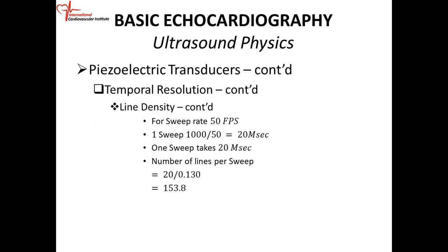When we did M mode a long time ago, when we had no image at all and it was just M mode ultrasound, it's not uncommon for us to use a frame rate of 3,000 frames per second.